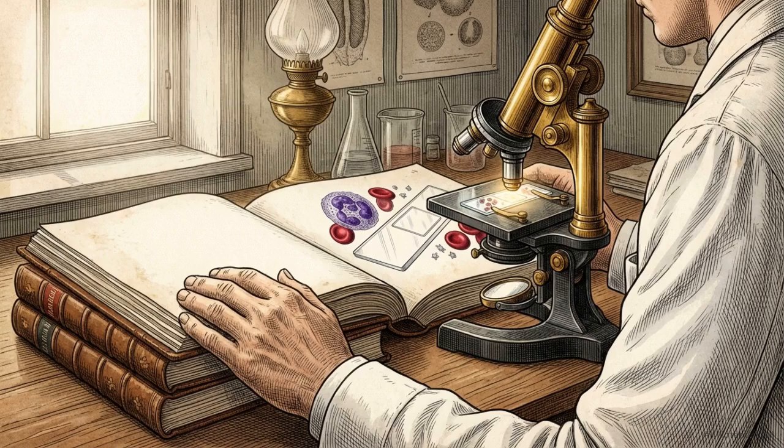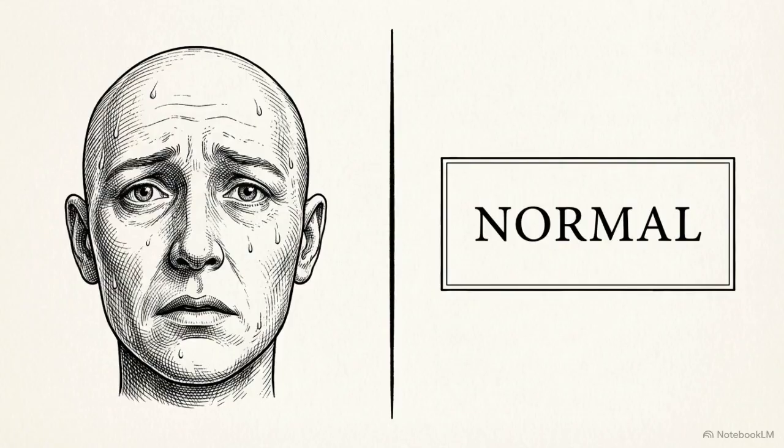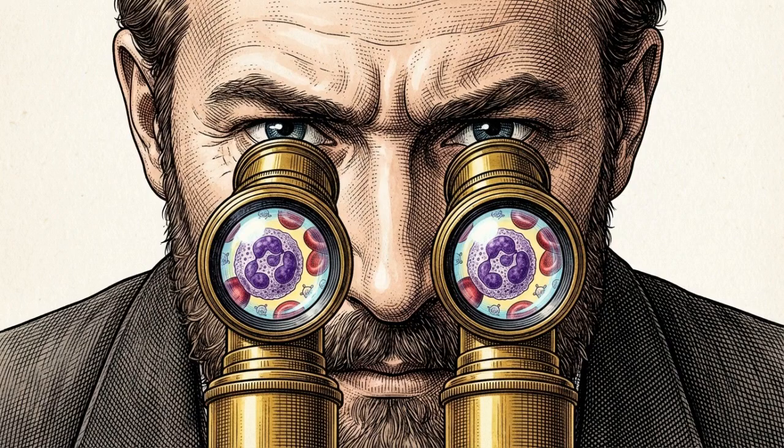Any severe or unexplained deviation in automated CBC numbers requires an immediate manual review of the peripheral smear. This rule extends to the physical presentation. Whenever a patient's symptoms contradict their automated lab numbers, a visual cellular check resolves the discrepancy. Despite modern advances in automated cytometry, the human eye analyzing morphological reality remains the definitive arbiter of hematological diagnosis.